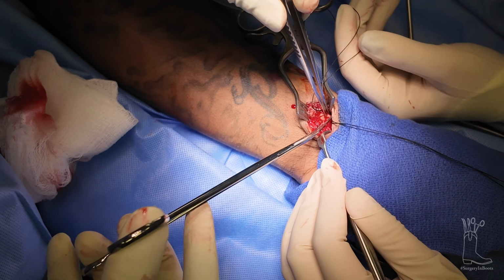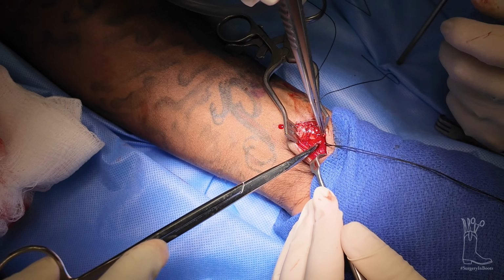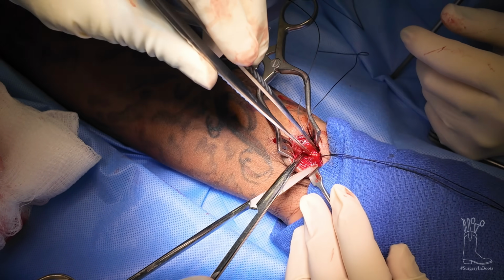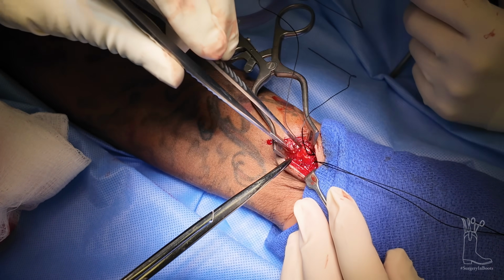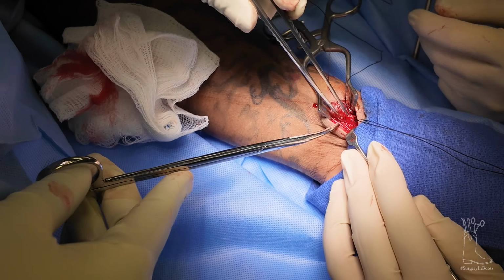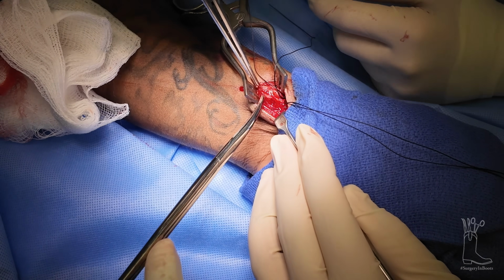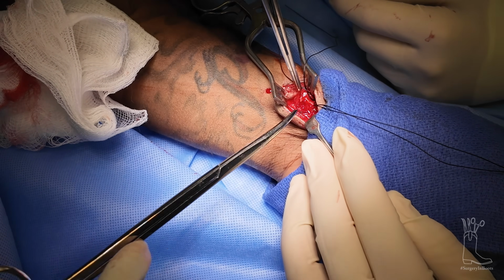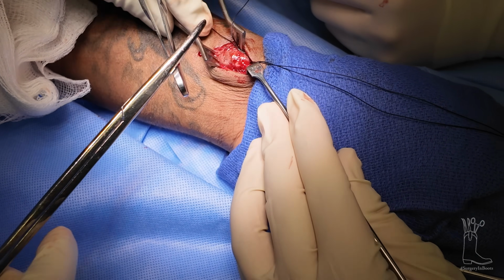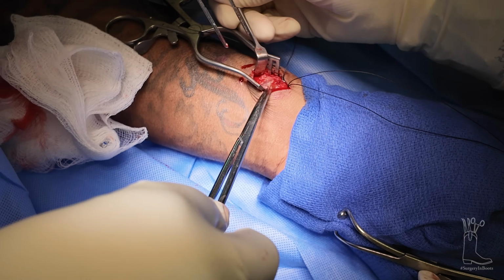So here's the cool part, the dude also has a ganglion cyst in the midst of all of this. So some of this is ganglion cyst, some of this is aneurysm. So we just kind of gotta dissect through and figure out which part is which. You know, last little bit. So yeah, that's fine.